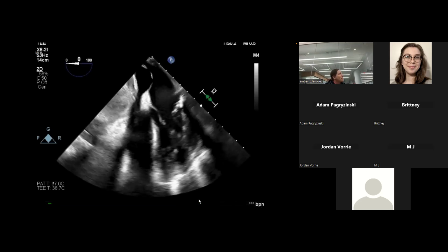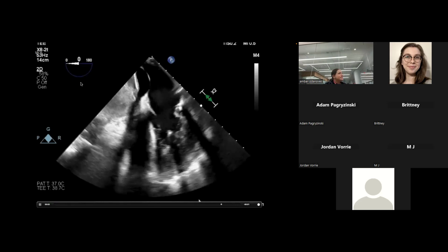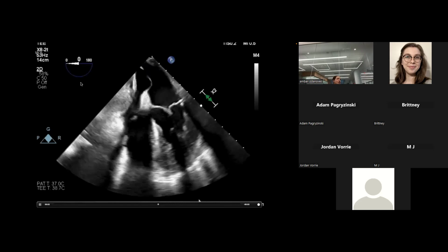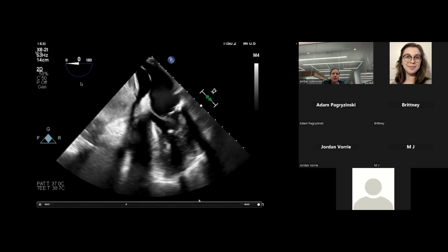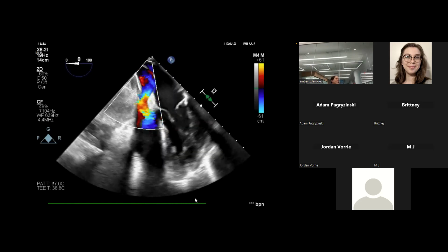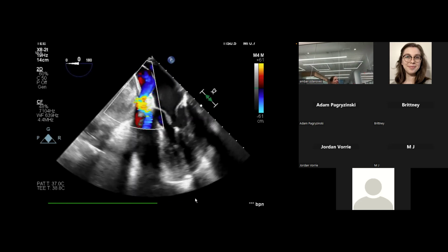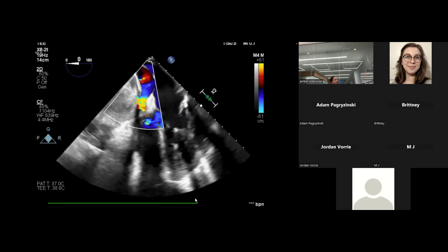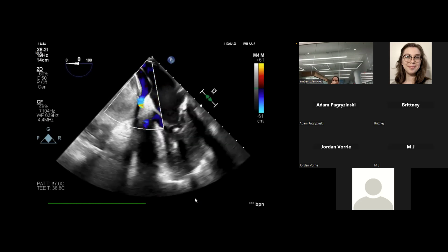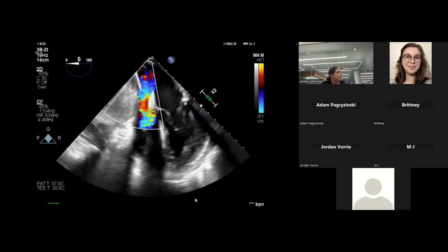The thing that looks abnormal to me is right there. That just looks like blood that's smooshing the right side, and the septum is completely moved over. Exactly. Atrial. So what do you think's going on? Tamponade. The blood was coming out, and then the blood stopped coming out. And where do you think that turbulent flow is? It looks like it's between the RA and RV. You probably have turbulent flow because it's all being completely smushed.